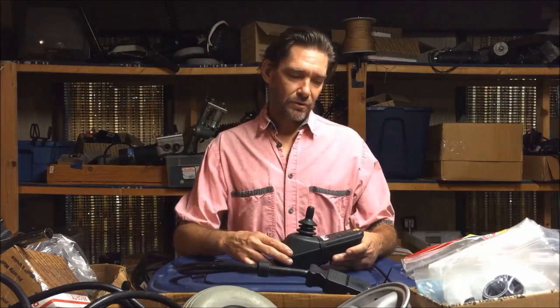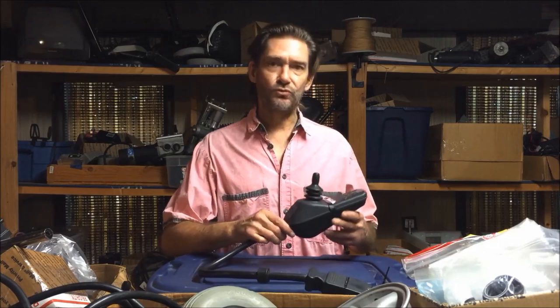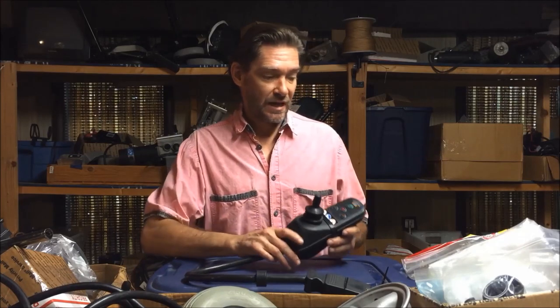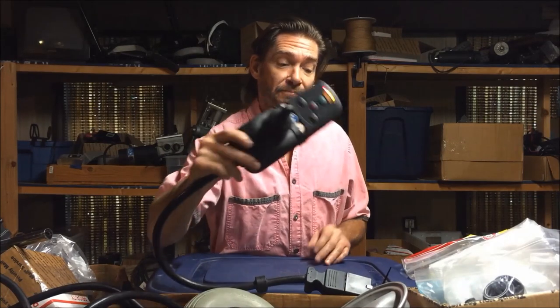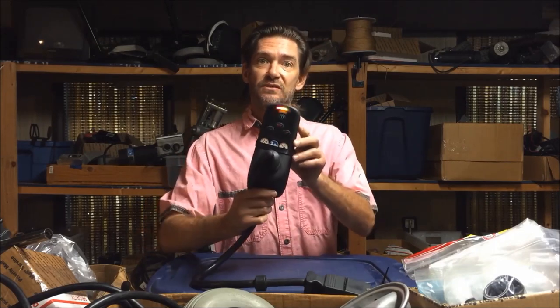I want to go through the things that are problematic about these. A lot of times your joystick will do something like this, and that's not good. You turn on your joystick — it was working fine the day before, or maybe six months before — and you turn it on and you're getting something like that. You're getting full bar flash. This is a joystick fault.